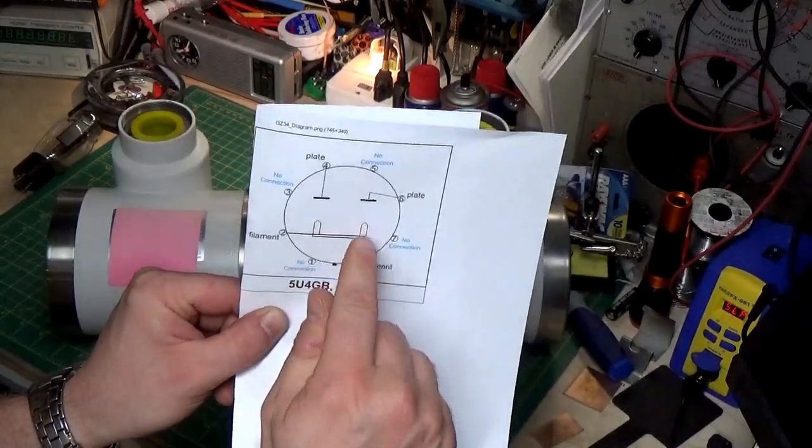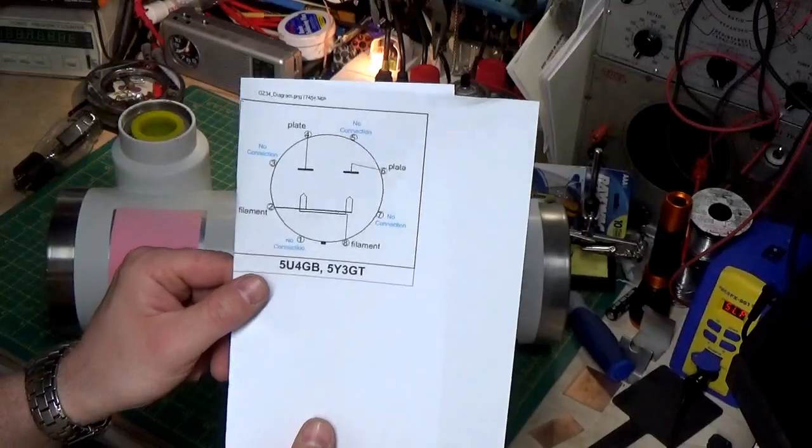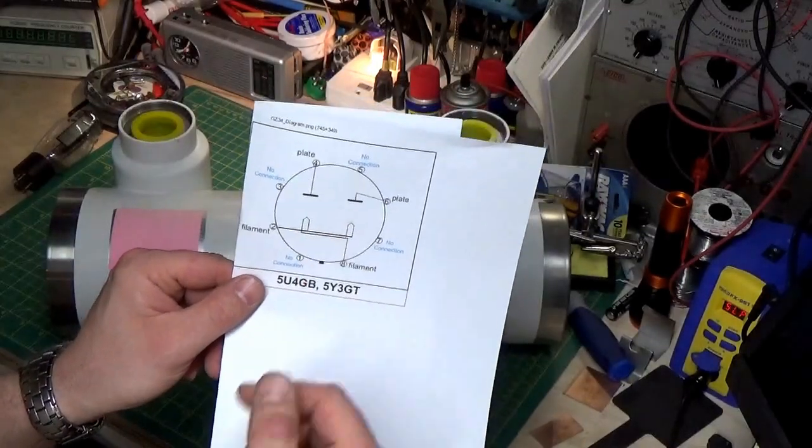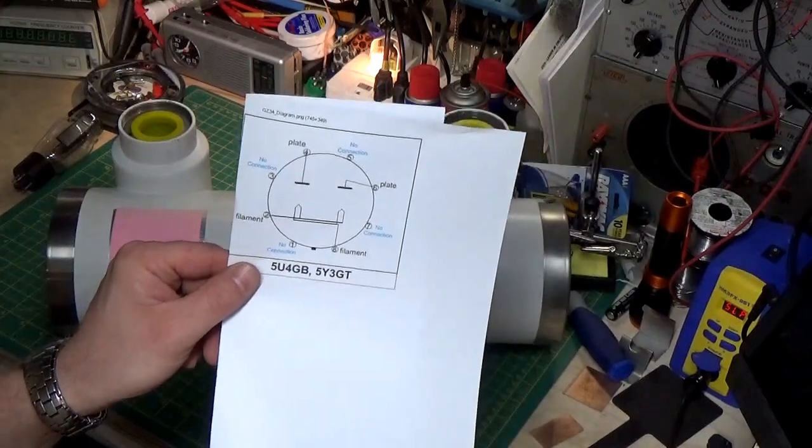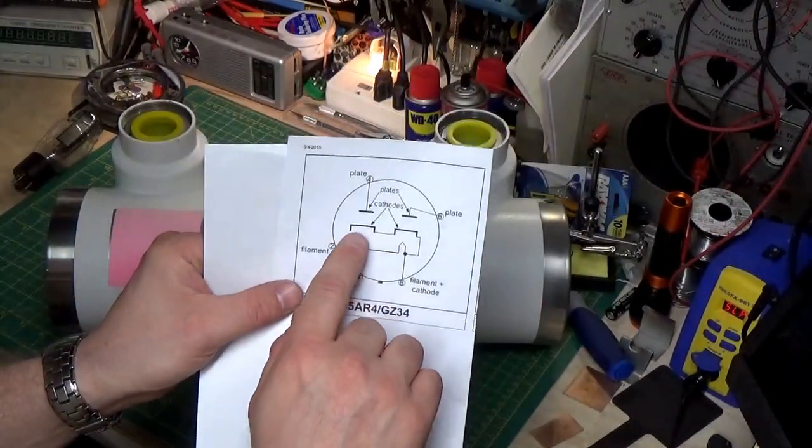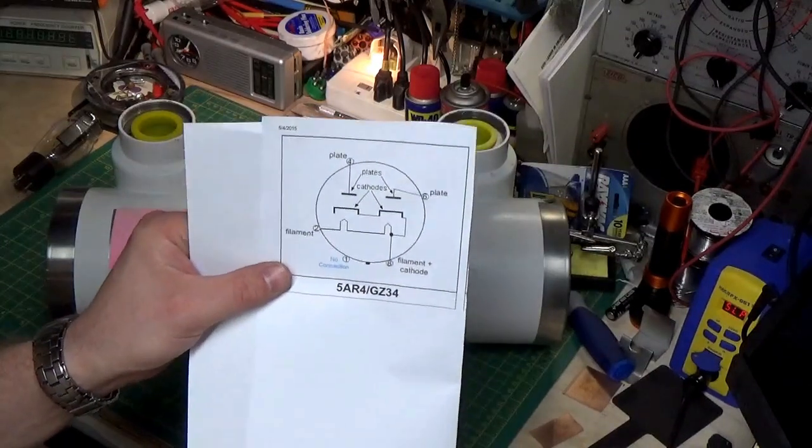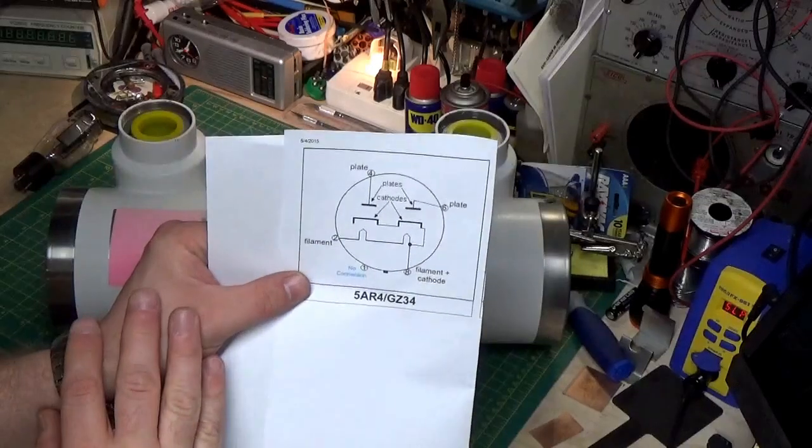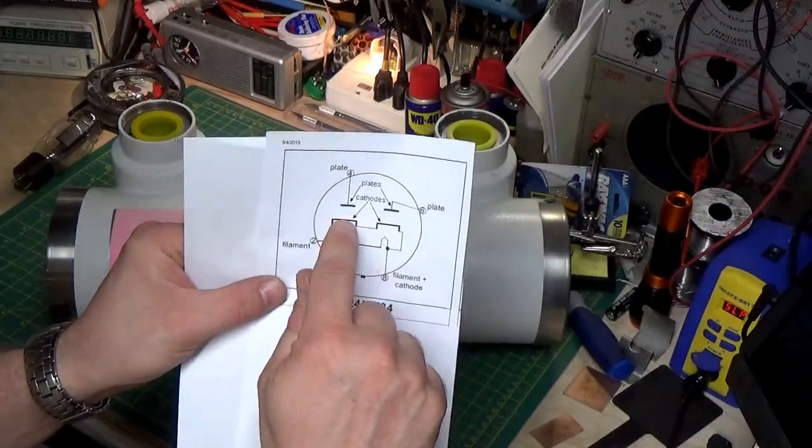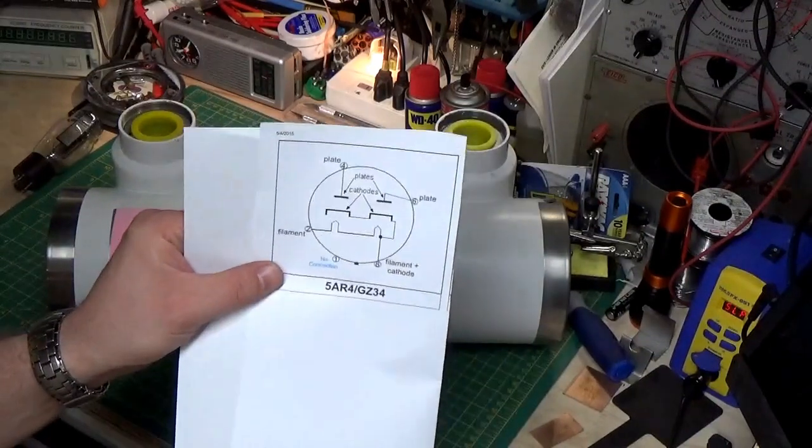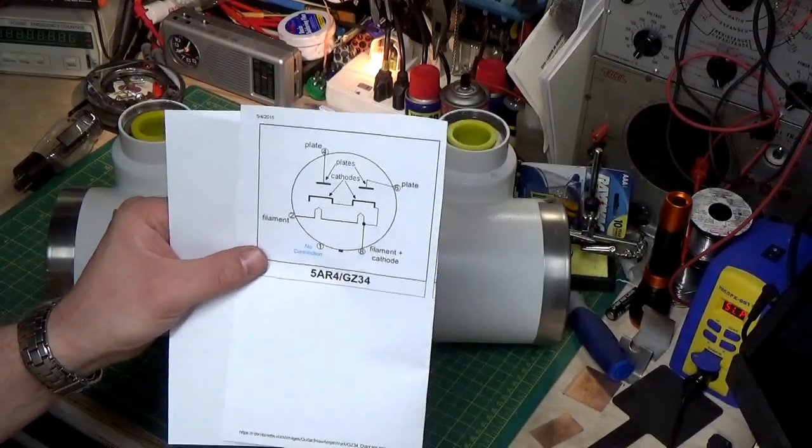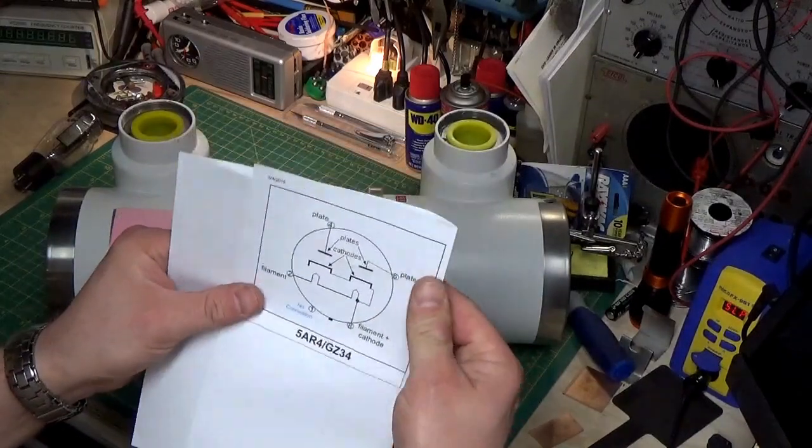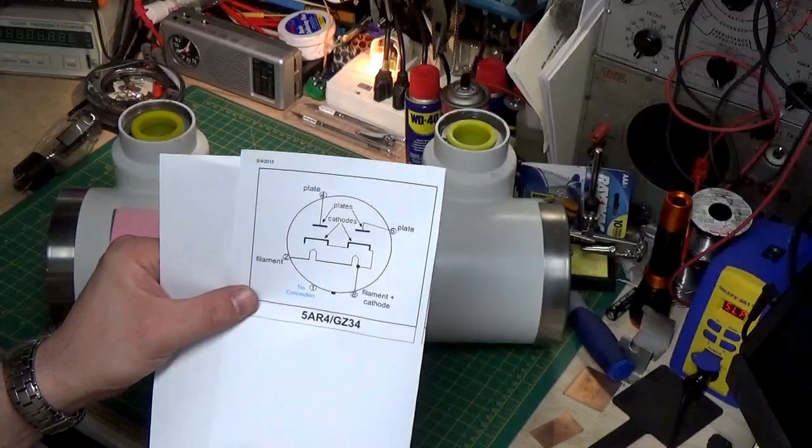And this is what we call a direct heated tube. Direct heated means that the filament itself is the cathode, so it's the filament and the cathode both at the same time. As opposed to other tubes that have an indirect heated cathode, meaning the filament heats another element. That element is what gets hot and gives off the electrons and allows current to conduct.